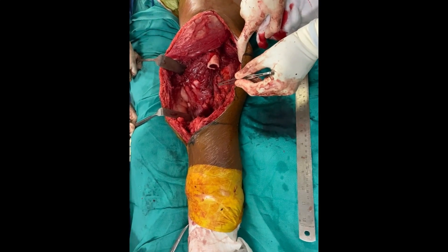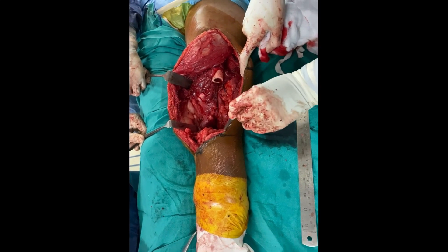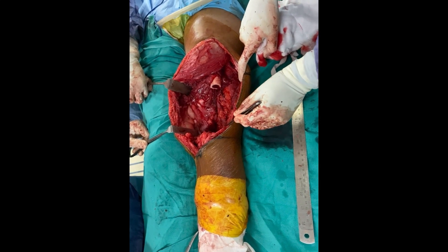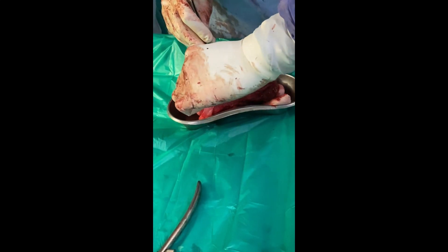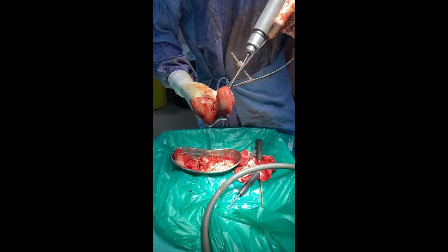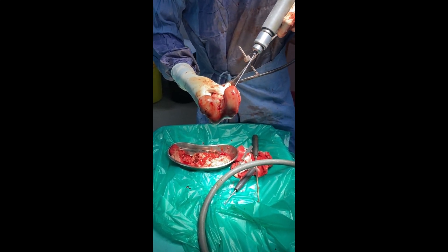Step 2: Soft Tissue Removal and Insertion of the Tumor Bone into Liquid Nitrogen. The soft tissues are removed and the bone is dipped into liquid nitrogen at minus 180 degrees temperature. The distal femur bone is placed over a separate sterile trolley, and soft tissue is removed from the bone tumor with the help of a surgical knife and periosteum remover.